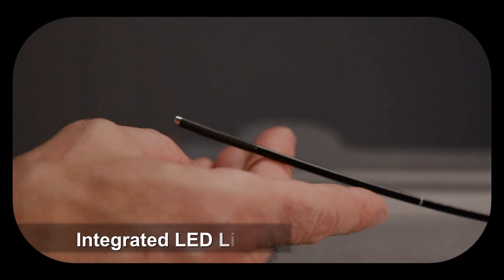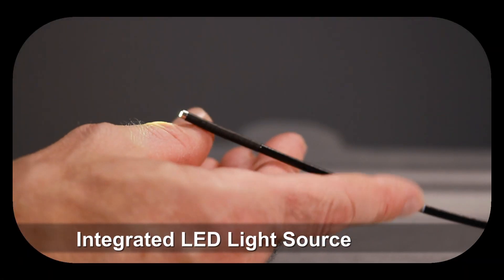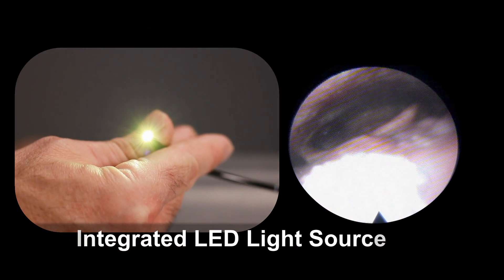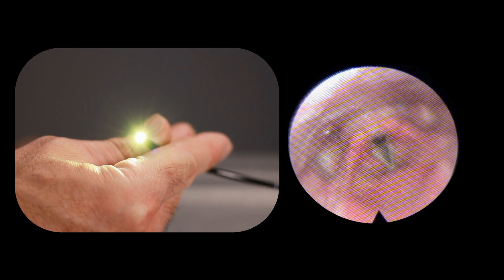The integrated LED light source eliminates cumbersome external lights, while providing exceptional visibility, enabling the most accurate diagnosis.